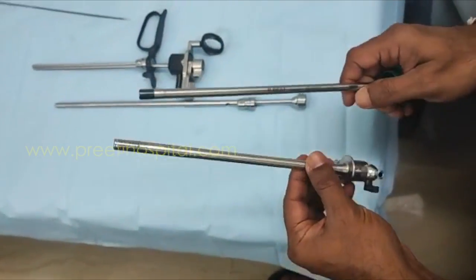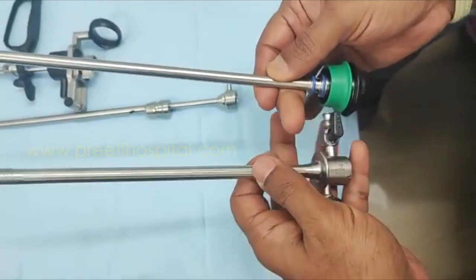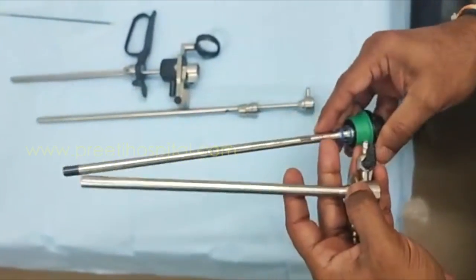This is the Wolf instrument. This is the Wolf one with 24 French — 24 by 22. So Storz is 26 by 24, and the Wolf smaller one is 24 by 22.